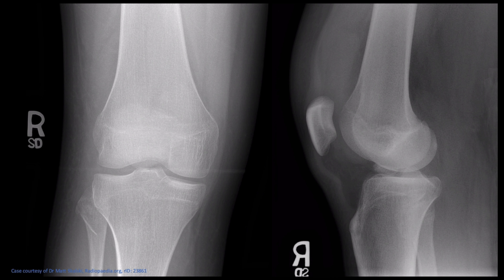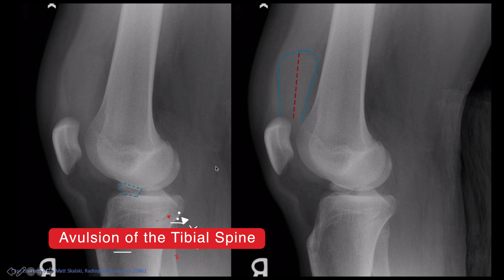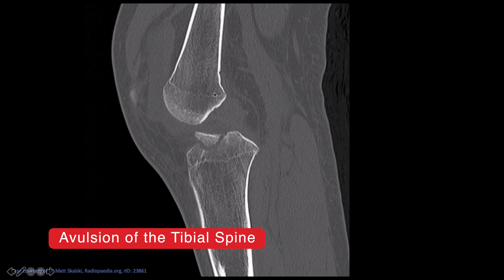This is an AP and lateral radiograph of a knee. The first thing that catches my eye is the presence of a large lipohemarthrosis. Tracing the bones all around, I see a bit of irregular bony fragment. You can't clearly see it on the AP radiograph, but there's a small radiolucent line that may correspond to that fragment. This is a lipohemarthrosis with a bony fragment - this is an avulsion of a tibial spine, shown on a sagittal CT scan.